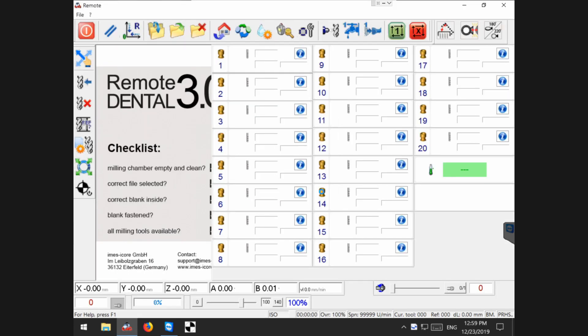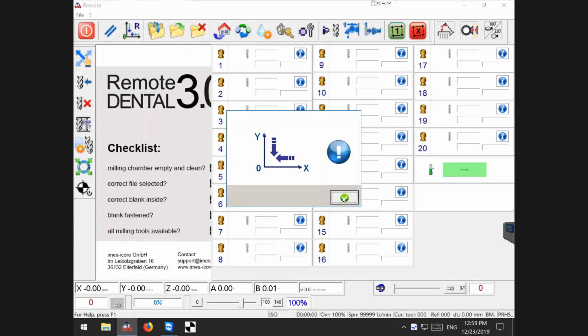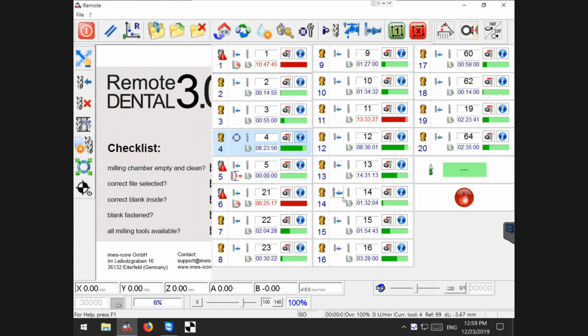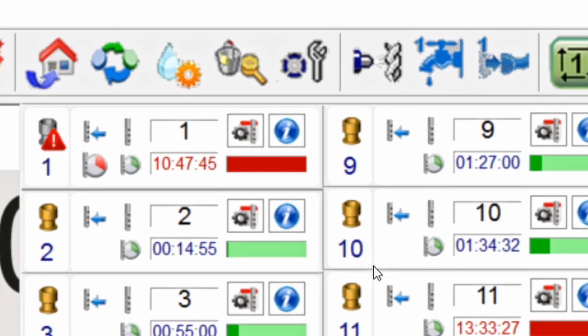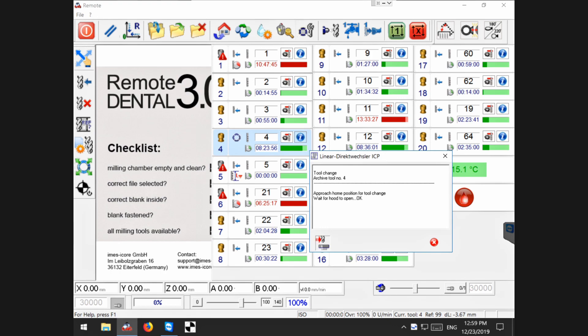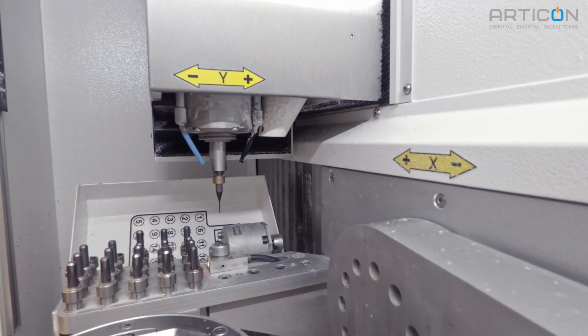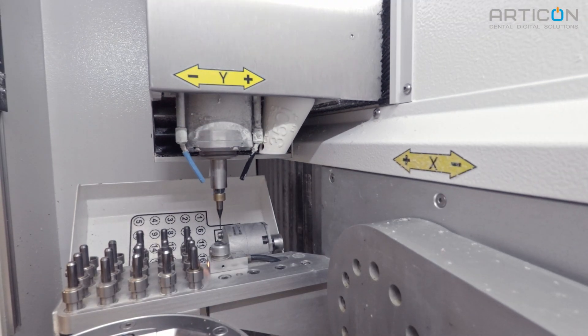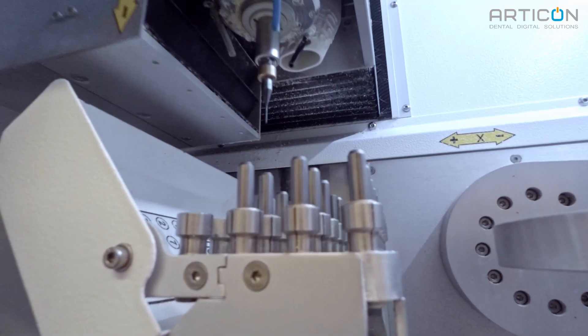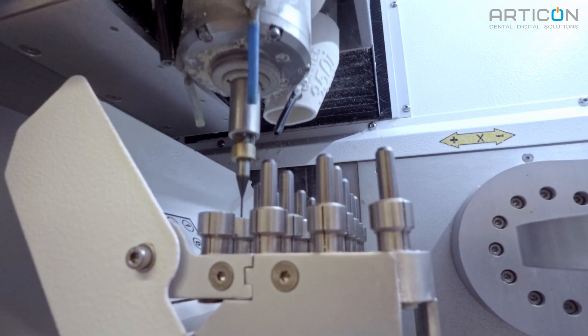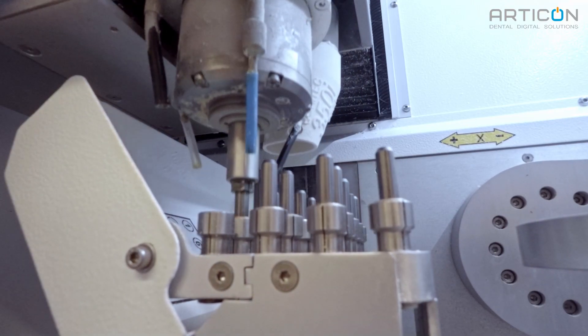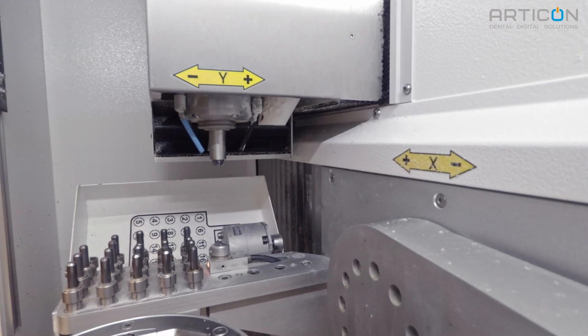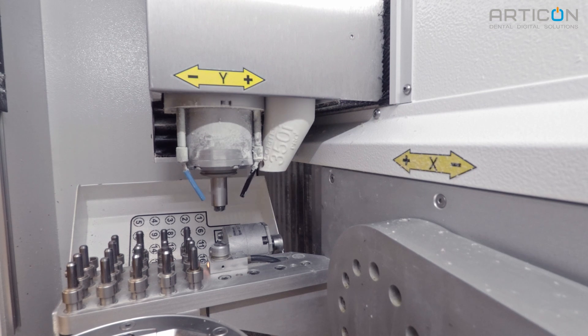Open remote software and after reference run is finished, tap the drive to service position button on the toolbar. The machine stores the milling tool into the tool magazine and drives to the service position.